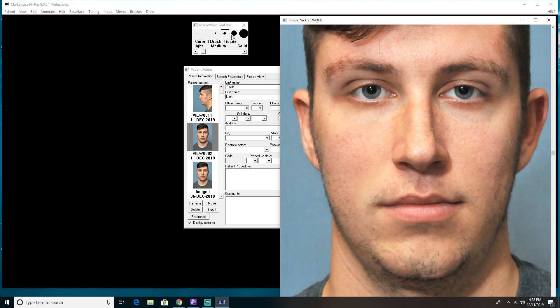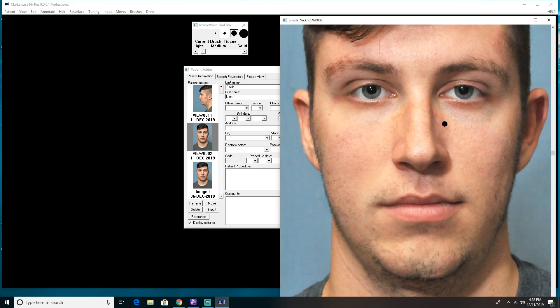I'm going to go back to the toolbox and choose a slightly larger size tool. I'm going to go over to my picture and try to fix this shadowed area. I'm going to click down with my Wacom pen on my Wacom tablet, click down in the shadowed dark area, and lightly sketch it down through the area that I'm wanting to darken. It's a very light, quick sketching motion. I want to soften this whole shadowed area.